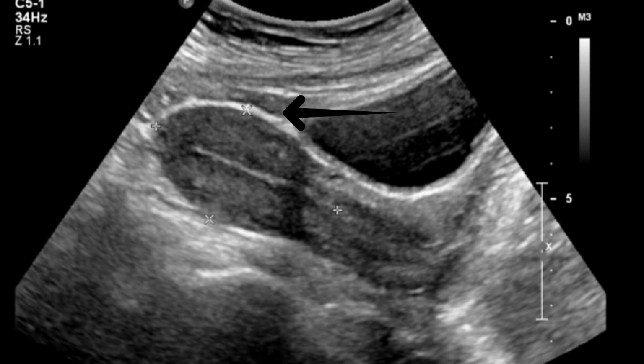This part of the uterus, which is the outer lining, is the serosa. This inner relatively hypoechoic, grayish in appearance, is the myometrium, and within the myometrium this hyperechoic straight line is the endometrium.